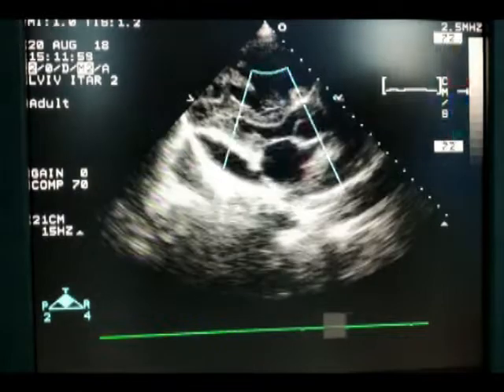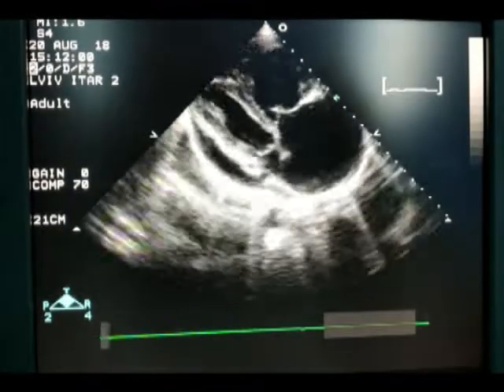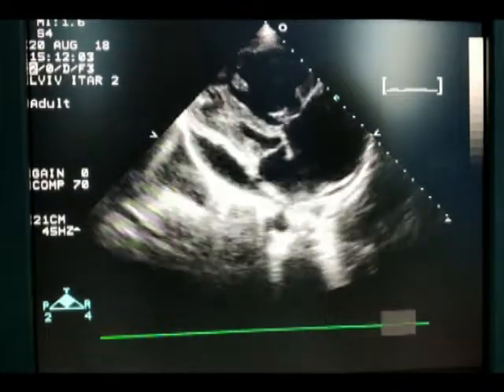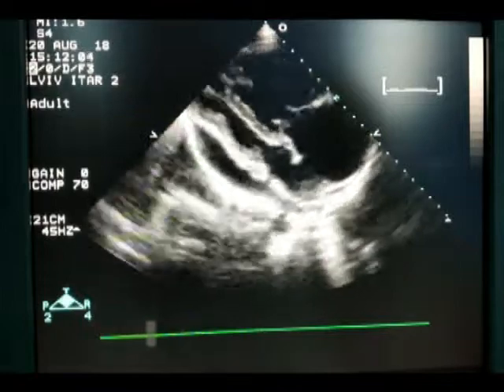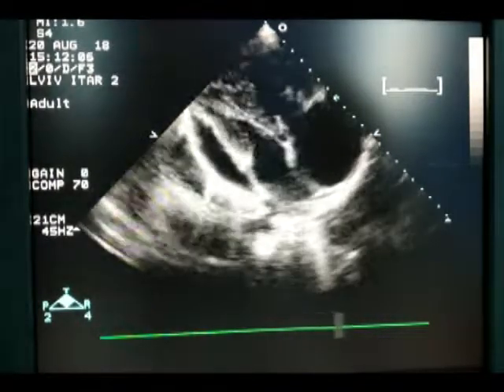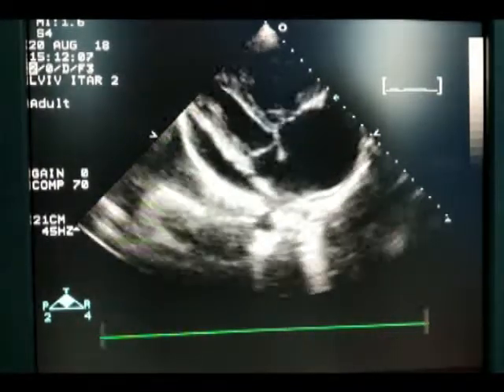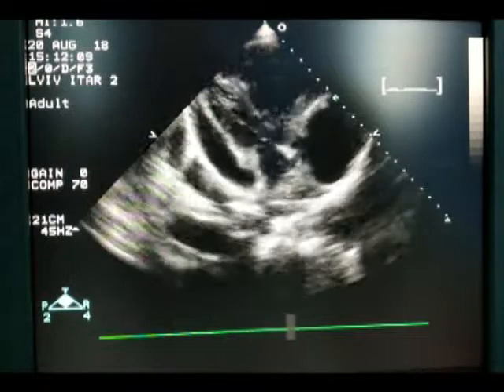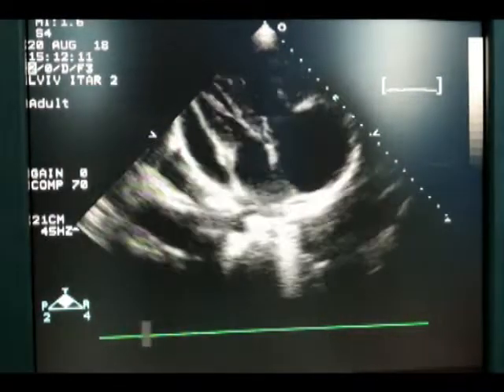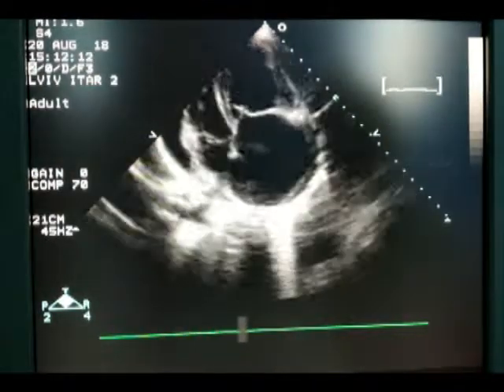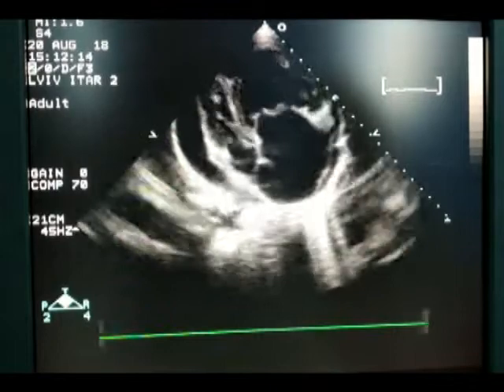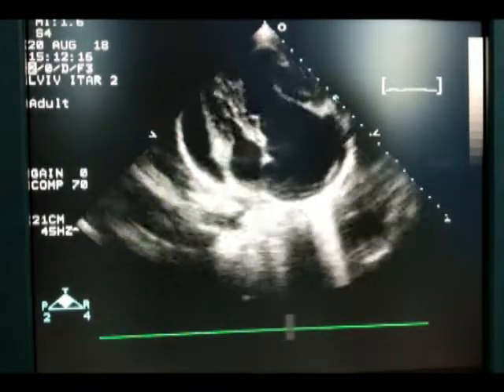Now we assess the left ventricular systolic function. The interventricular septum is moving paradoxically and participates in the contraction of the right ventricle. But in spite of this, the left ventricle contracts normally and the ejection fraction is normal. The cavity of the left ventricle is small.